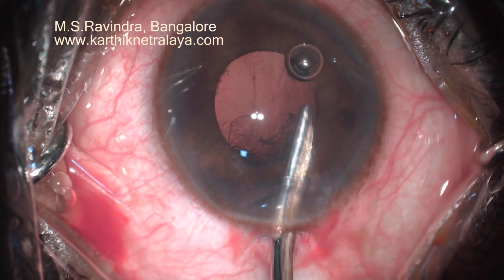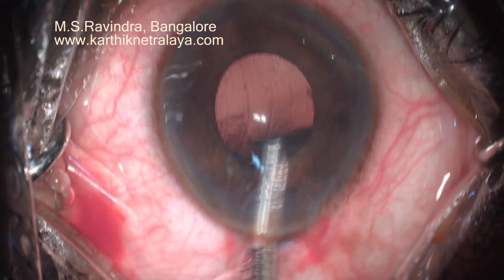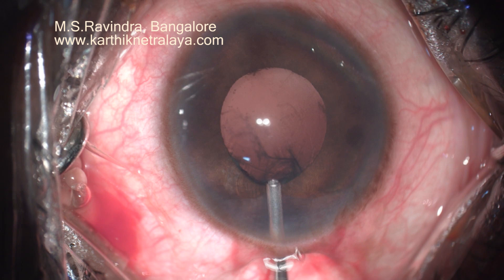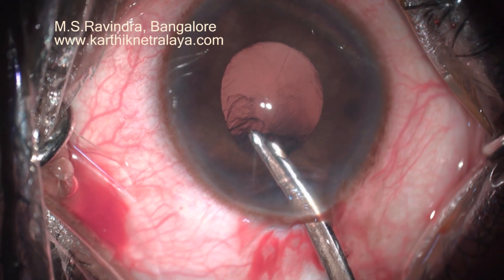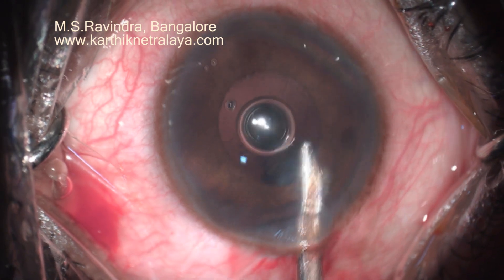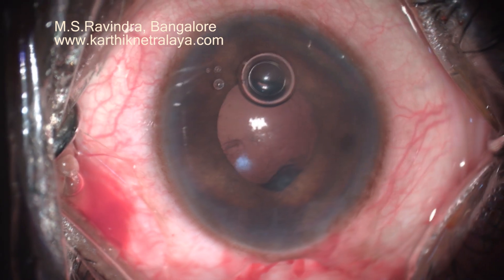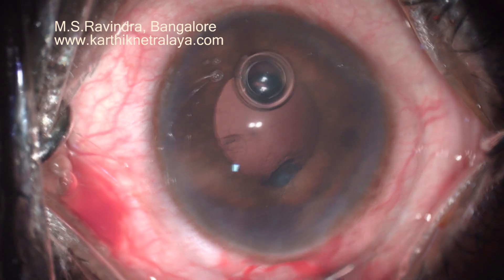Zonules are very fragile and the capsular bag can come out at any point of time. So I am extra careful, re-injecting the visco into the anterior chamber repeatedly and keeping the AC deep. The pressure inside the eye is a little on the higher side, so there can be capsular bag loss at any point of time. But luckily it did not happen. I kept on injecting visco and deepening it. The only visco that I needed was HPMC in this case.